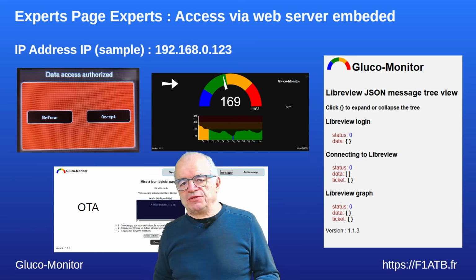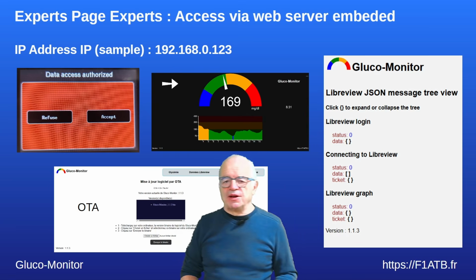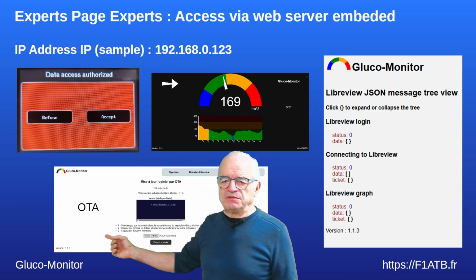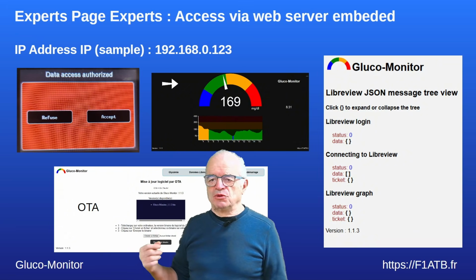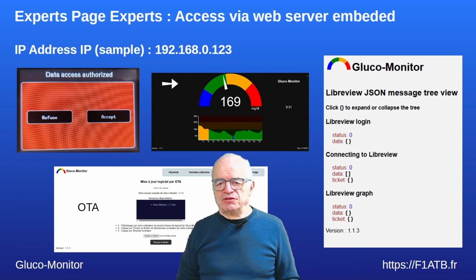In the future, if there are some evolutions of this software, you can reinstall the software completely with a new version, or you can do an update by OTA, what we call over the air, via the Wi-Fi, directly from the PC. You order Gluco-Monitor to install the latest version.